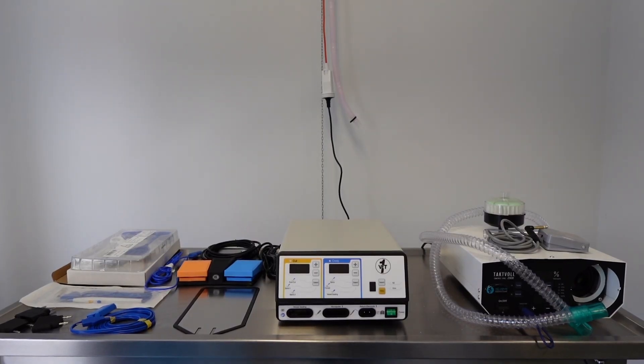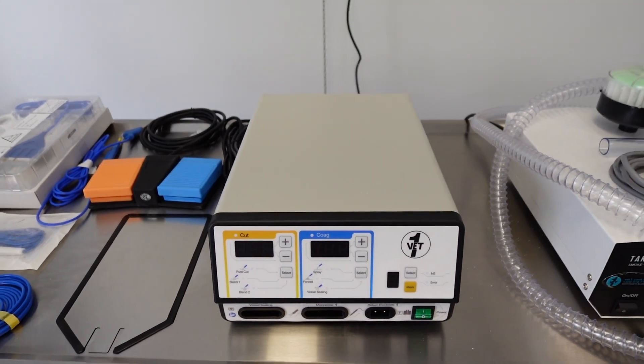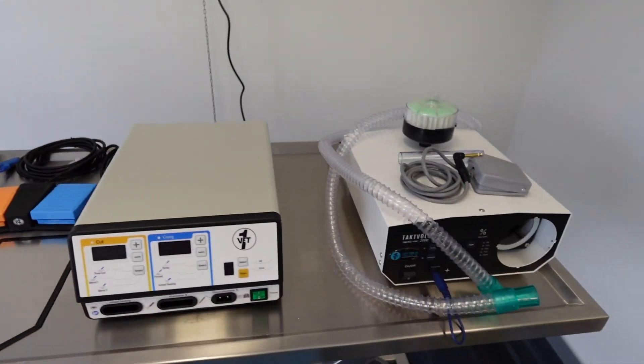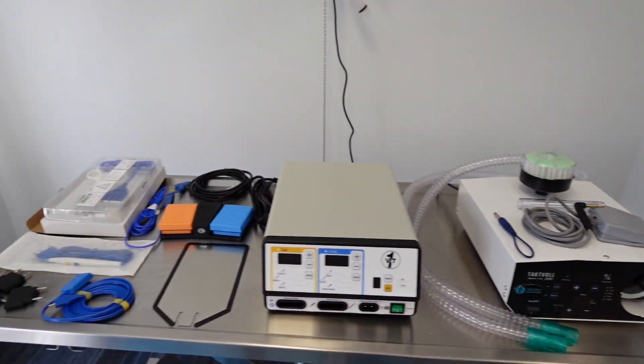This video is going to go over a basic setup for an electrosurgical generator and a smoke evacuation system, and how to connect the two together. We'll look at all the components that come with your electrosurgical generator and then go over the components that come with your smoke evacuation system.